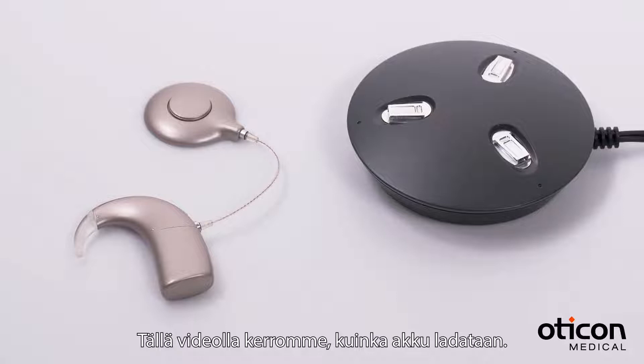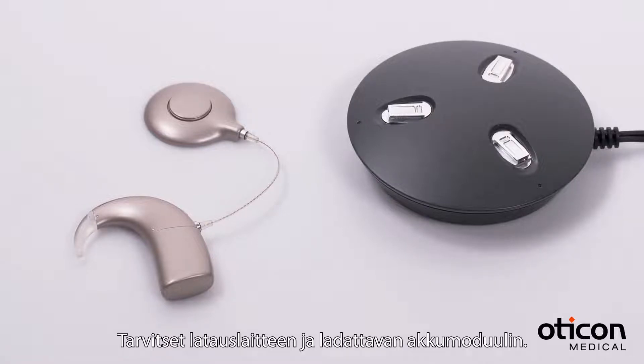This video shows you how to charge a rechargeable battery. Here's what you'll need: a charger and a rechargeable battery module.